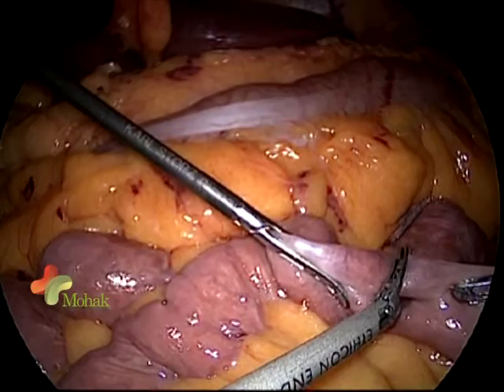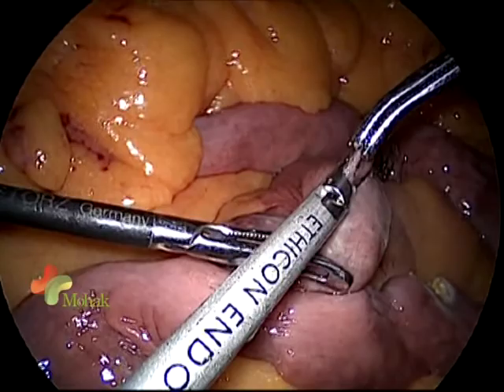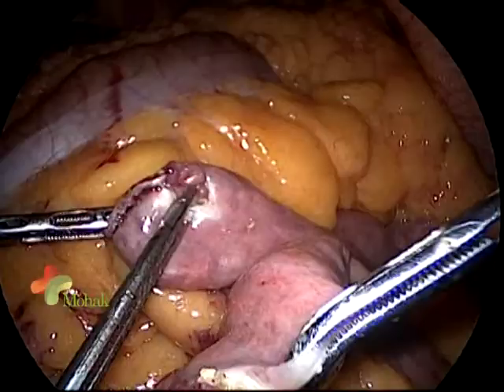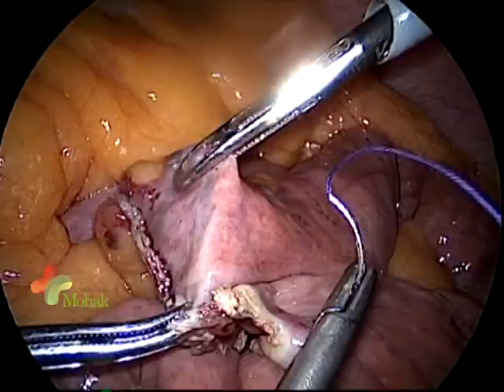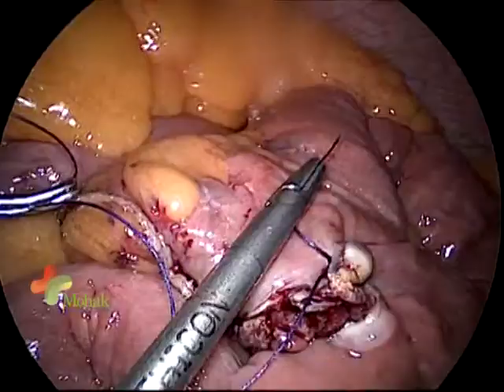We will count 110 centimeters and then anastomose with the biliopancreatic limb. I take a harmonic and make an enterotomy, dilated with the harmonic only. At the three o'clock position we insert a white cartridge to do the anastomosis. We previously used a blue cartridge but now use a white cartridge as it is more hemostatic for anastomosis with thin jejunum. I will now close this defect using Vicryl 2-0, as we do in conventional open surgeries.